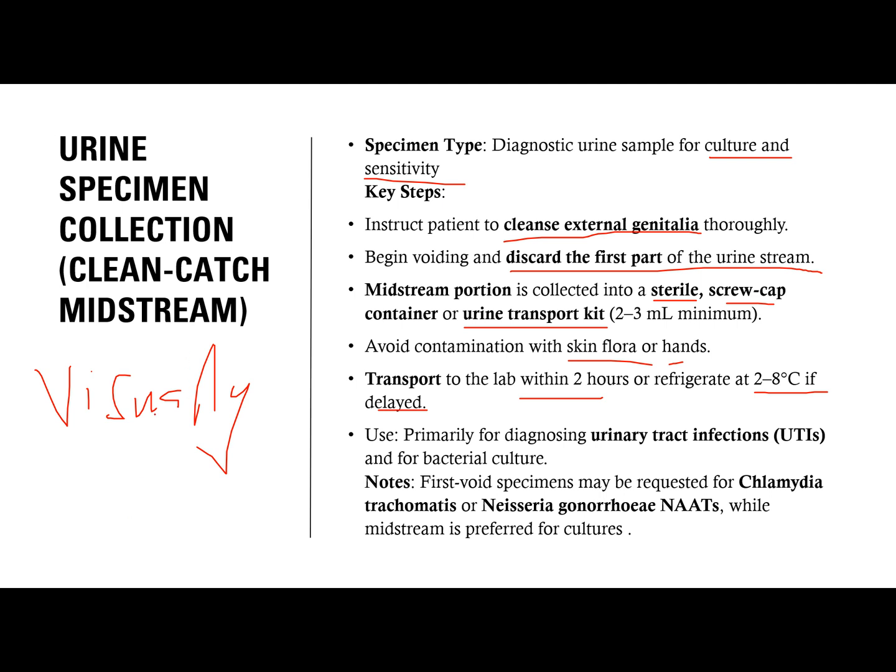You could identify the urine if it has UTI in some cases or in majority of cases if the urine is turbid. Kapag ang ihi ng pasyente sobrang turbid, sobrang labo, the most likely case is that the patient is suffering from urinary tract infection. Now, they would use this for bacterial culture.